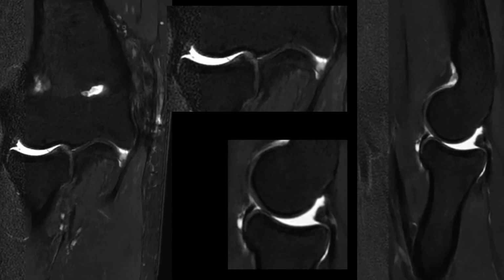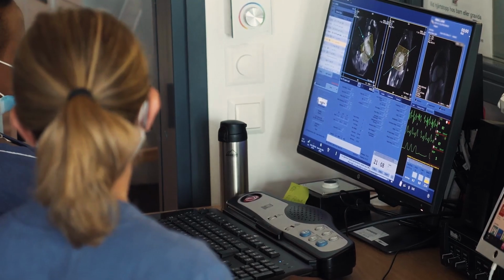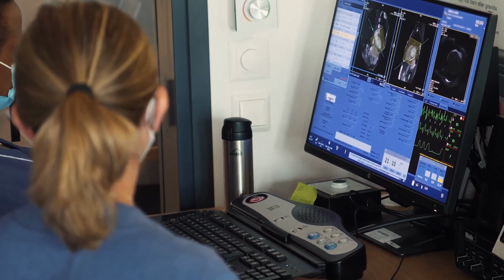For a lot of children, we're just able to get the scans done before they've reached the limit of cooperation that they're going to give us. It's going to make a big difference that we can get excellent quality studies in shorter time when it's appropriate. And that's going to be a big drive of the hospitals to get through the backlog which has built up. So yes, absolutely. In the past, if we'd gone to the number of excitations that we're using now with DL Recon, it would have been non-diagnostic. There's no point in doing that. So yes, absolutely, it already made a big difference.